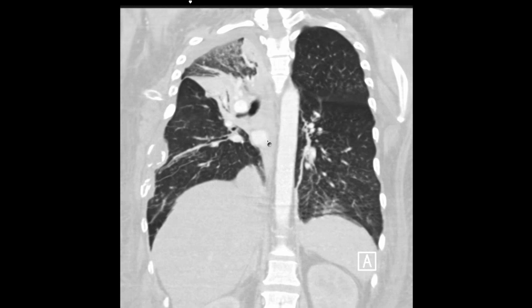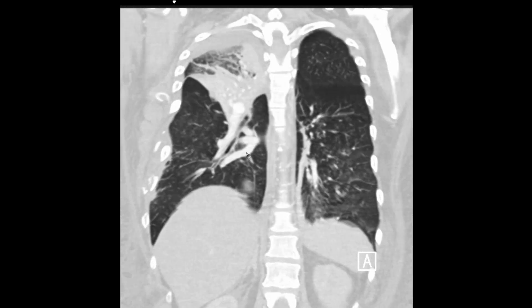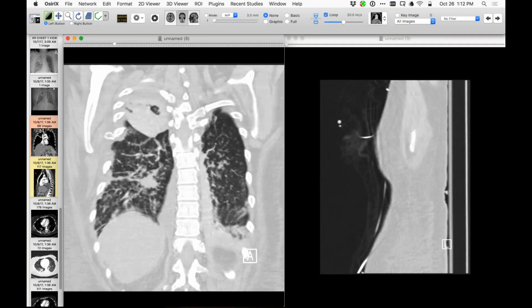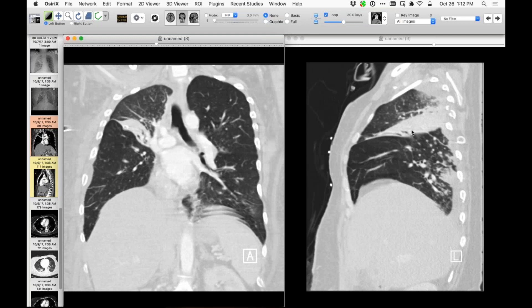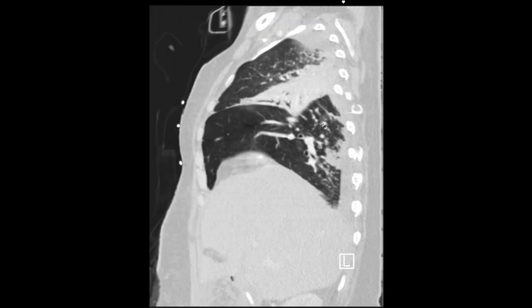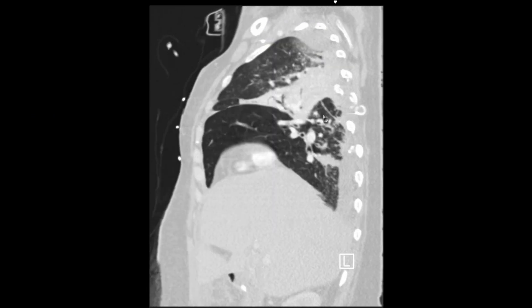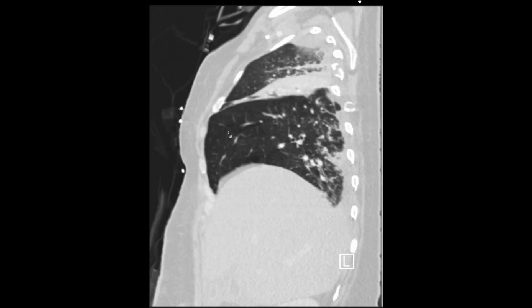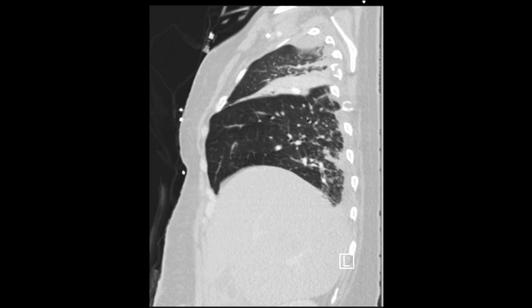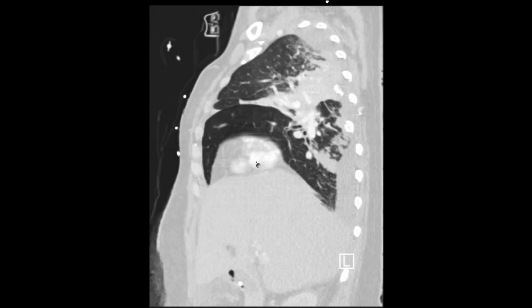For the lateral projection, here is the middle lobe — that's atelectatic, with some air in it. Here's the upper lobe, with quite a bit of atelectasis in the posterior segment. And this is all the overexpanded, particularly anterior basal segments, of the right lower lobe. The findings going forward in time support the notion that this is right middle lobe atelectasis. What I showed you initially is the elephant ear sign of right upper and middle lobe atelectasis and the hyperexpanded right lower lobe.